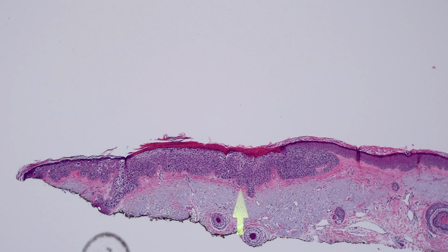Here we go. So the epidermis here, you can see normal over on the right. And then over here we have acanthosis, a thickening of the epidermis. And the epidermis is way more cellular than usual. Look at the normal layer over here. And then over here it's very hyperchromatic because there's a bunch of large nuclei packed closely together. They're hypercellular. And you can also tell the change in the corneal layer. Look at this nice basket weave stratum corneum here. That's kind of nice and lacy.